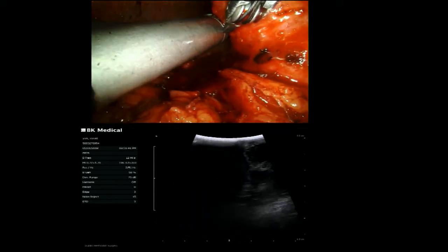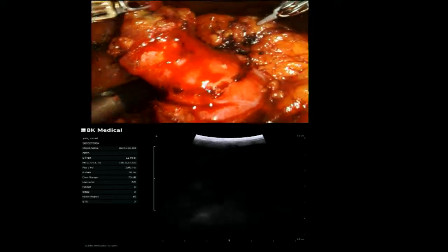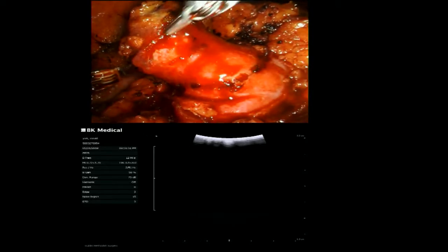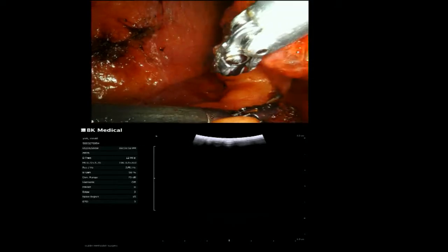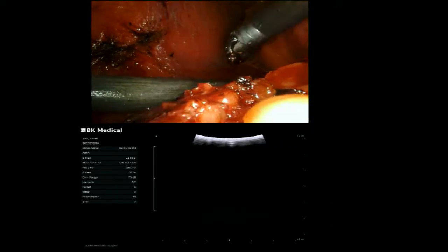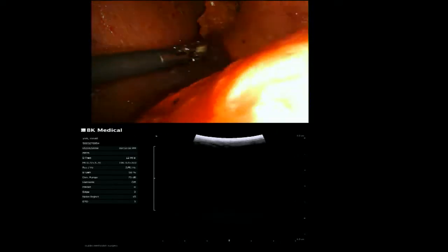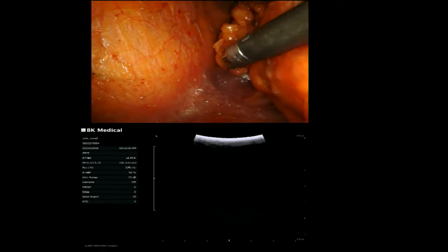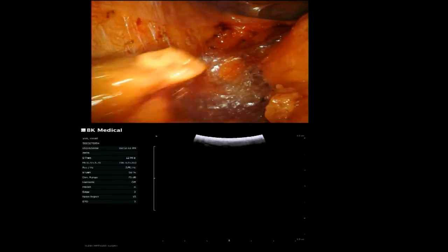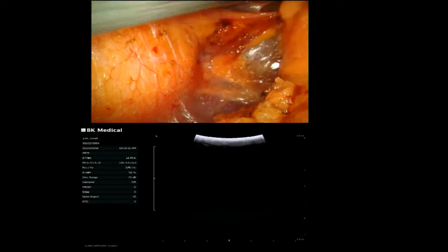One comment I would make, Ronnie, this is Jay, is I was always a little bit more conservative on the margins. And then I adjusted it as I got better at putting the CT image in my mind and correlating that with the actual anatomy. So it always helped me to be a little conservative when I first started resecting tumors. Yeah, I think that's the way to go, because most guys that are going to be doing partials are not going to be doing 200 a year. They're going to be doing 20 a year.